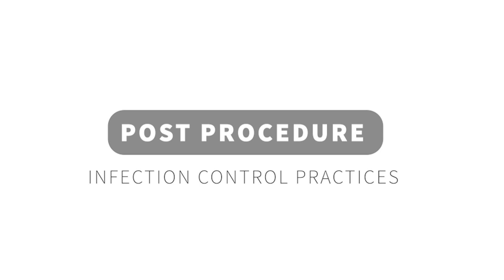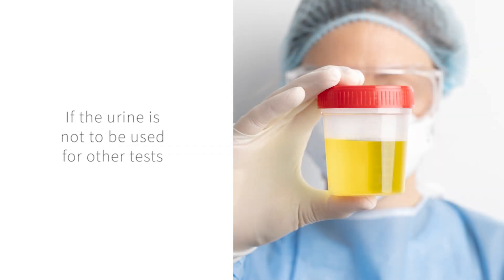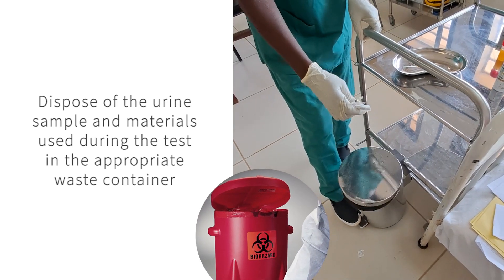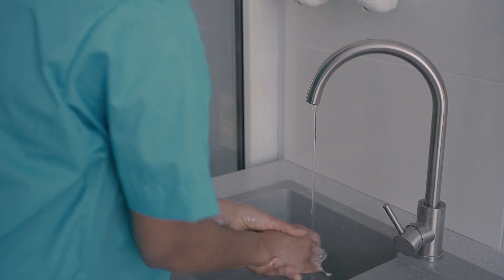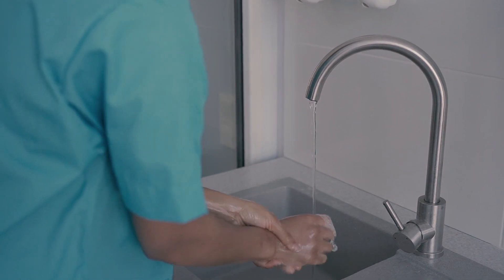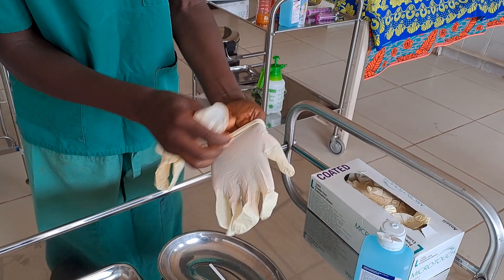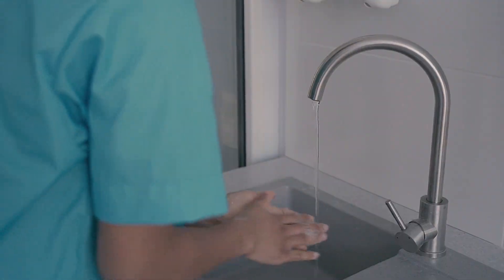Post procedure. The following steps should be followed to ensure infection control practices are maintained. If the urine is not to be used for other tests, dispose of the urine sample and materials used during the test in the appropriate waste container. Thoroughly wash your hands with soap and water because body fluids were touched. Put on clean non-sterile gloves and disinfect any surfaces used for the procedure. Thoroughly wash your hands with soap and water.